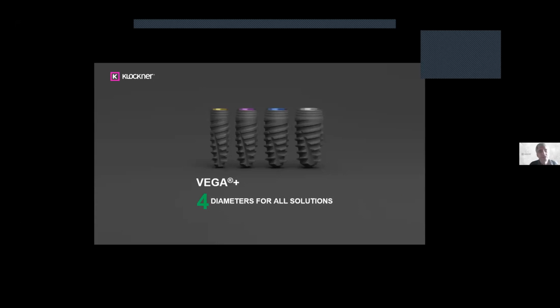I will show you some cases with very narrow spaces in an inferior central incisor with a 3.0, in this case it's a 3.1 implant. And you know, in many perio cases, the crown is very long and we have to use very, very thin implants. And what we want is to do screw retention, not cemented.